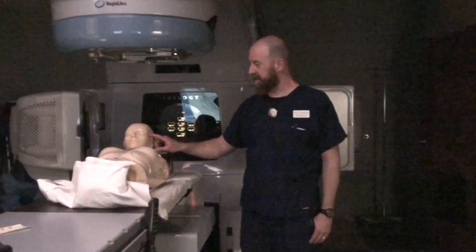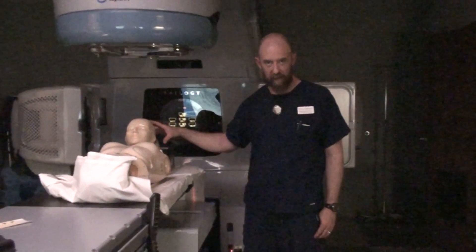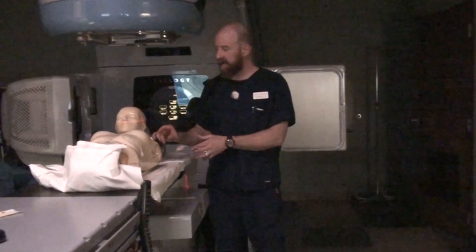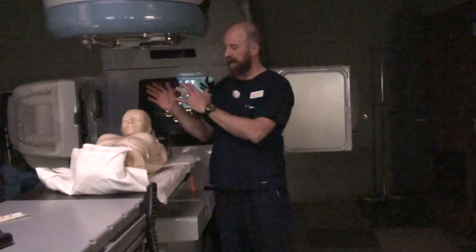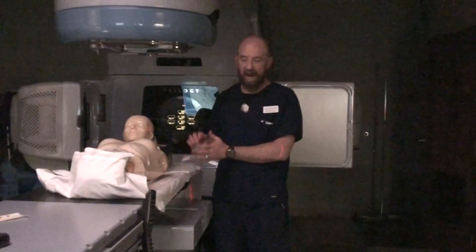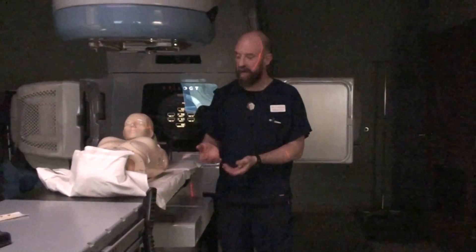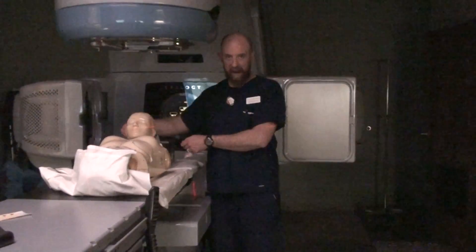Now that we've demonstrated where the outer canthus is and where the eye is, we're going to make our mask. All the stuff in the previous video was to ballpark the patient and make sure that you have the eye inferior to any of your potential treatment fields before you make the mask, because it's difficult to re-tilt the head after a mask is already made. So leave the BB on, leave the patient in place, and make your mask.